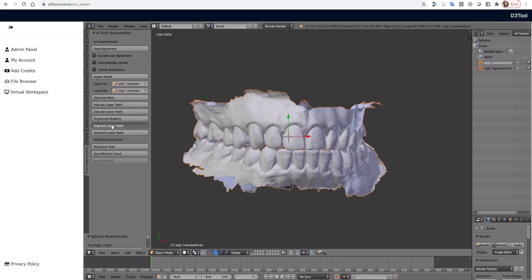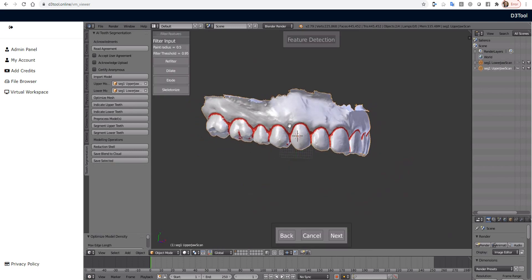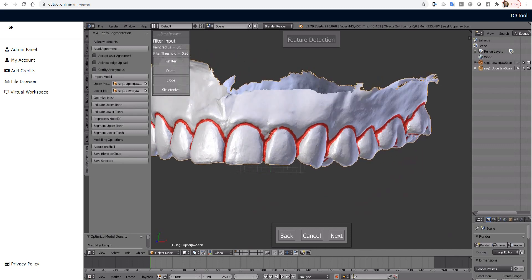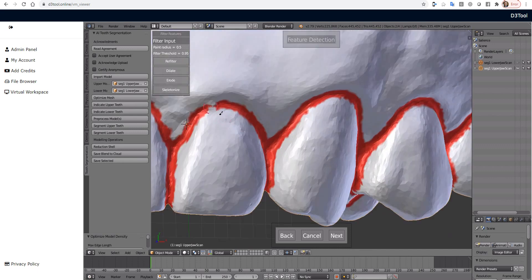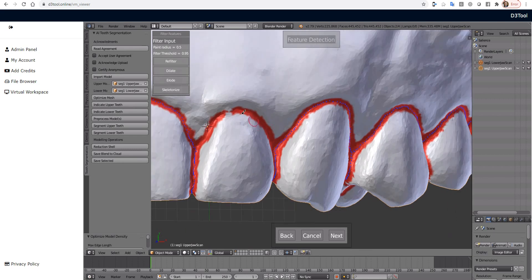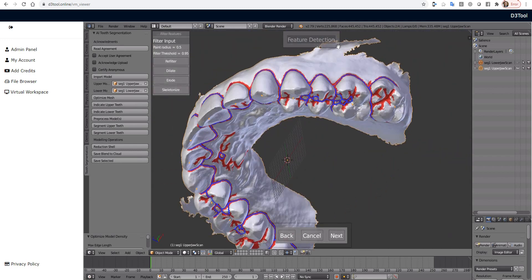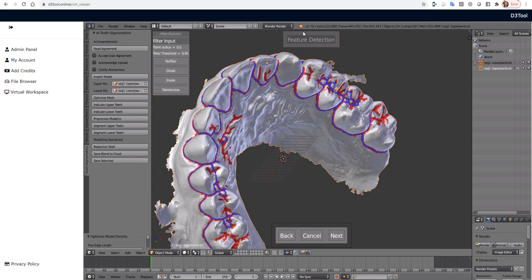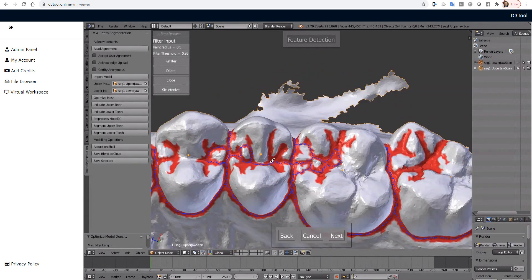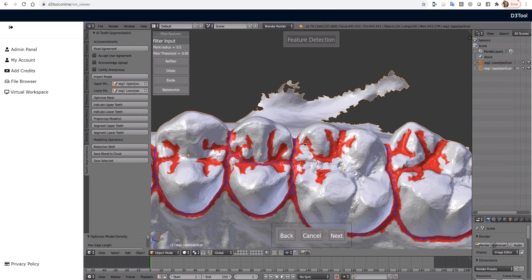Now we're going to segment the upper teeth. So if your scan is nice and clean and has really sharp, crisp, gingival contours and crisp embrasures, this is going to do a pretty good job right off the bat. So what you need to do is just look around for any spots that might have been missed. So if you press Skeletonize here, that's going to show you in blue everywhere it could find a little walking path. So basically it just tries to walk around all the red highlighting. And then you'll also be able to see any areas that were over-segmented quite commonly on the grooves. So I'm going to right-click here just to break these up a little bit. You don't have to delete it all as long as you break the loop. So you can check that by pressing Skeletonize again.